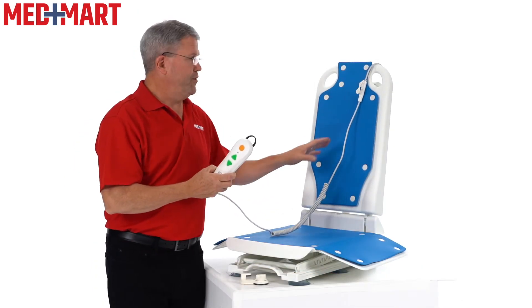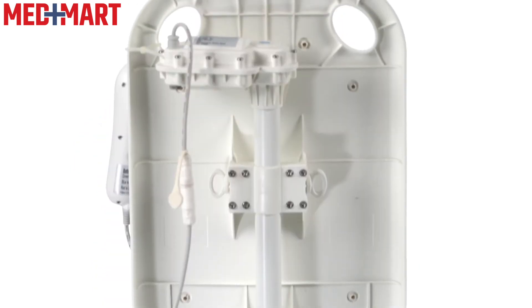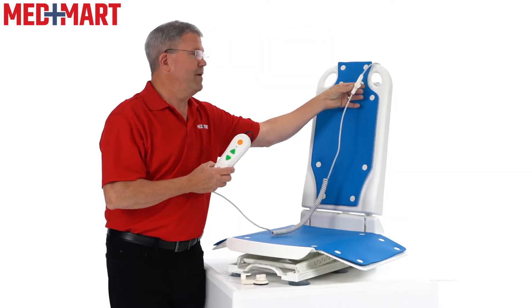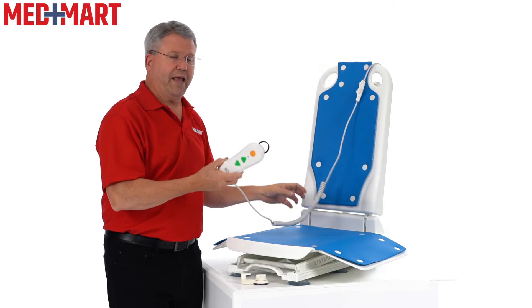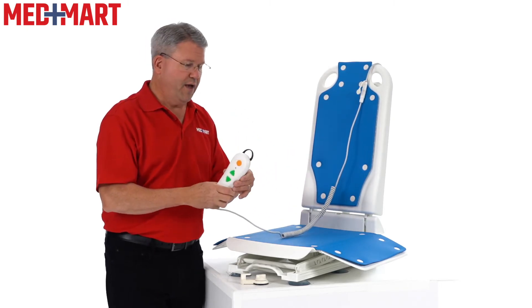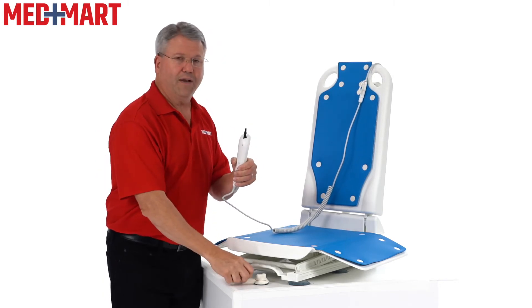The hand control itself is waterproof. If you notice, it connects up to a point that keeps it out of the water. This is a water-resistant connection, but I would recommend not keeping this part submerged. If it drops into the tub, that's fine — it's waterproof — but it's also convenient to keep it hanging on the side.